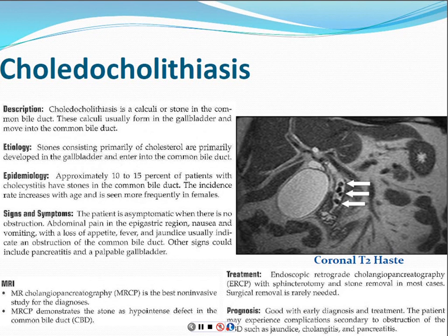So you could see maybe that the ducts are dilated but not know that there's a stone in there until you do an MRCP. This is something we see a lot of in the hospital. It's a fairly quick test. You don't need any contrast for this, as you know, and it gives them an idea of what the patient needs as far as the next step in management.